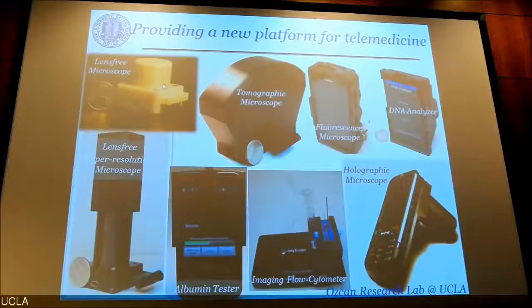Sometimes we utilize the imager, the silicon chip, the CMOS imager of a mobile phone, and create standalone devices that are used for high-end microscopy. For example, I'll give you some highlights of how these types of devices work. The one that I point to here is generating about a billion useful pixels. A gigapixel image of a tissue sample of a Pap smear can be created with these very inexpensive and lightweight devices. So they're really also advancing the current state of optical imaging and optical microscopy.